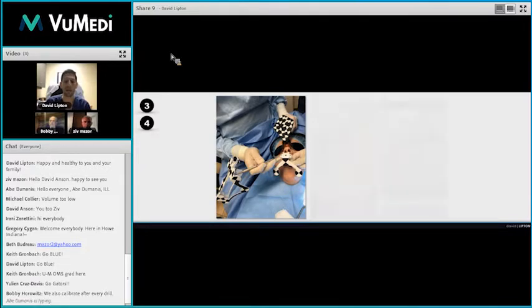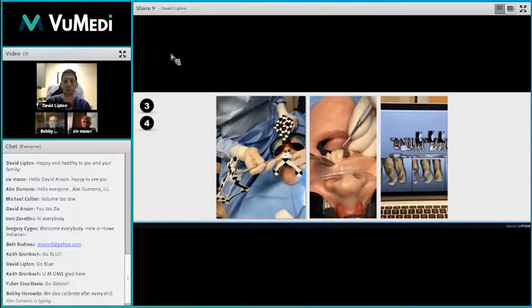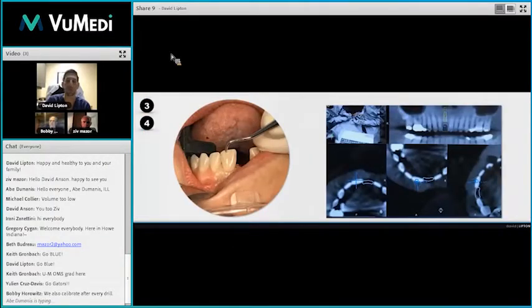And once again, this video illustrates where we're just tracing one of the teeth that we selected, and once that's completed, we're going to move on to our accuracy check to confirm what we're touching in the mouth is correlating to what's going on in the computer. If for some reason it's not matching up, we're going to go back and retrace again, which takes no more than 60 to 120 seconds to do the tracing. It's a short, quick thing.